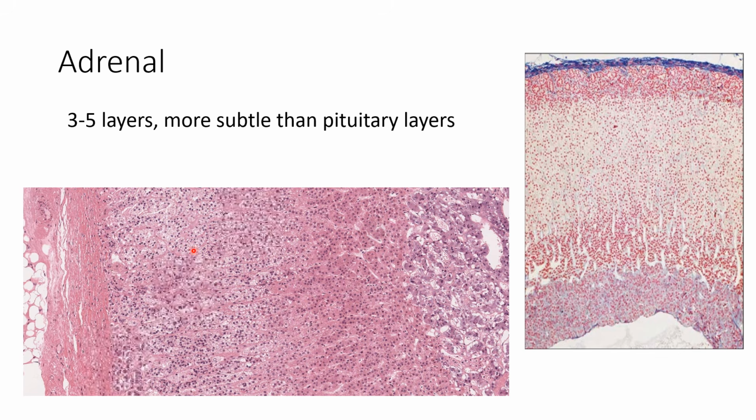And then if you also look for the medulla, this is the medulla in here. It is a darker region, or it's usually very distinct compared to the other regions. It's always not the same shade of red or purple. Apologies to anybody that is colorblind. You're out of luck on this one.